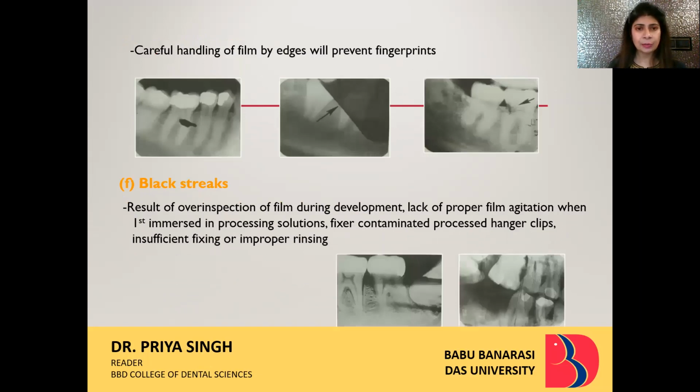Careful handling of film by edges will prevent fingerprints. Now, many a time it's seen that the technique has been done properly, the exposure is done properly, even the processing has been done, but during processing, the fingernails will lead to scratches, will lead to finger marks over that particular region. So avoid holding the film from the surface; you should always hold the IOPA film from its edges. Very important. Otherwise, it will lead to a major artifact.